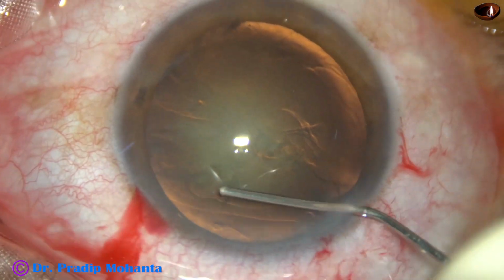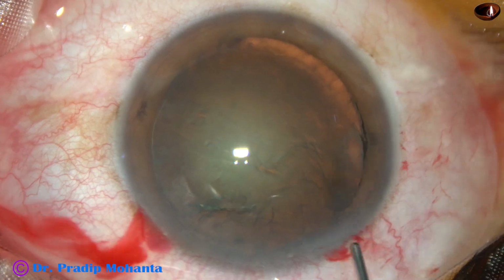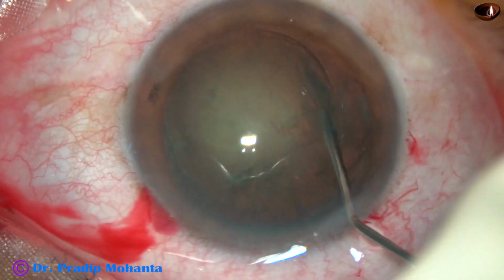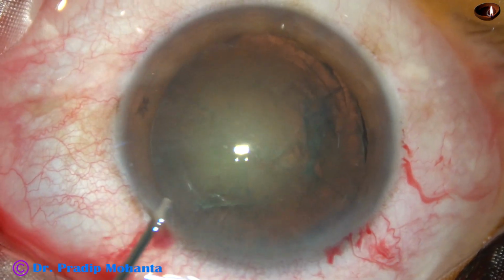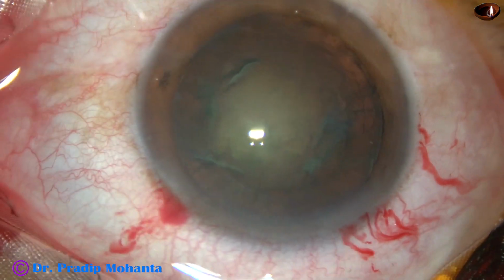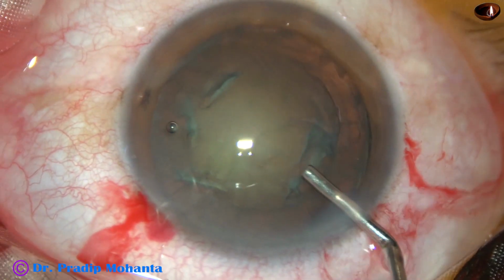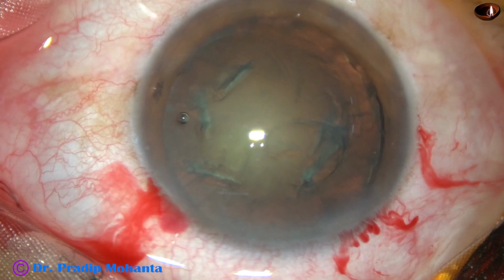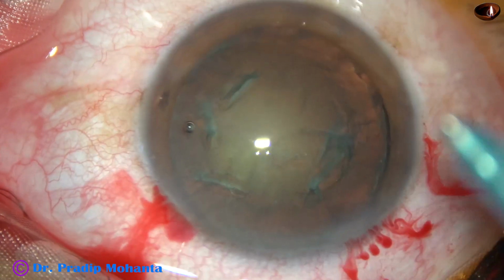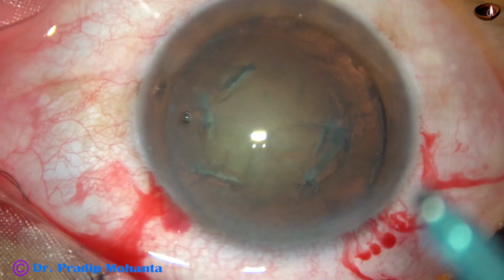This is hydrodissection and this is hydrodelineation. Hydrodelineation was attempted, but it was not good. The nucleus is rotated. Visco is again injected, and now is the time to introduce the tip of the phaco needle. This is a totally unedited recording of the surgery.